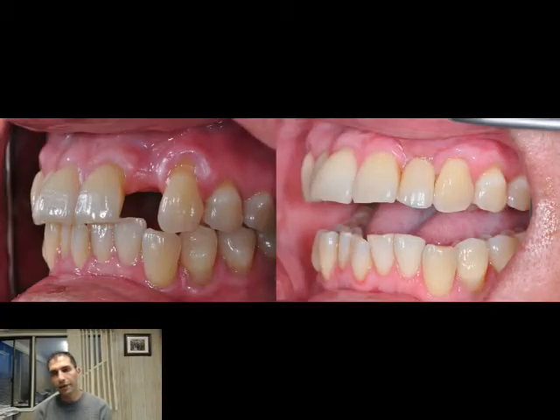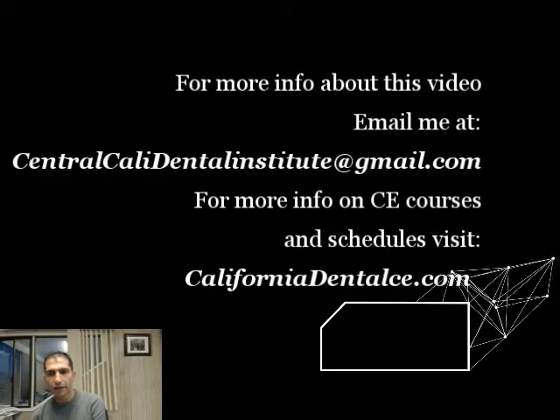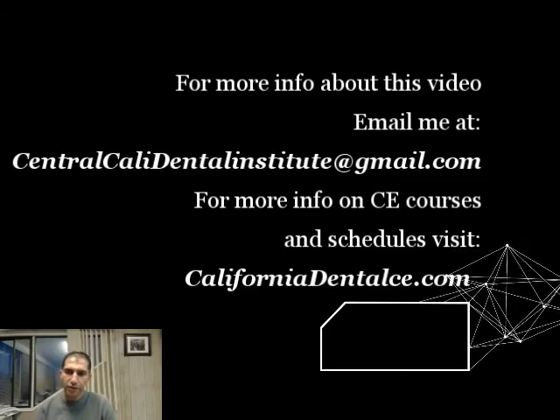You can appreciate the chroma match, and also the maturation of the tissue — because the connective tissue, as time goes by, continues to mature. This is Ferris Erasic. Thank you very much for watching.